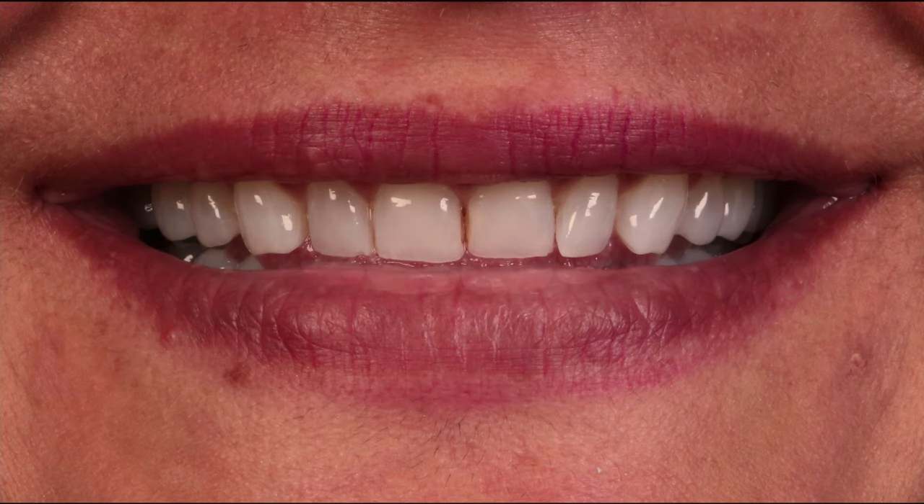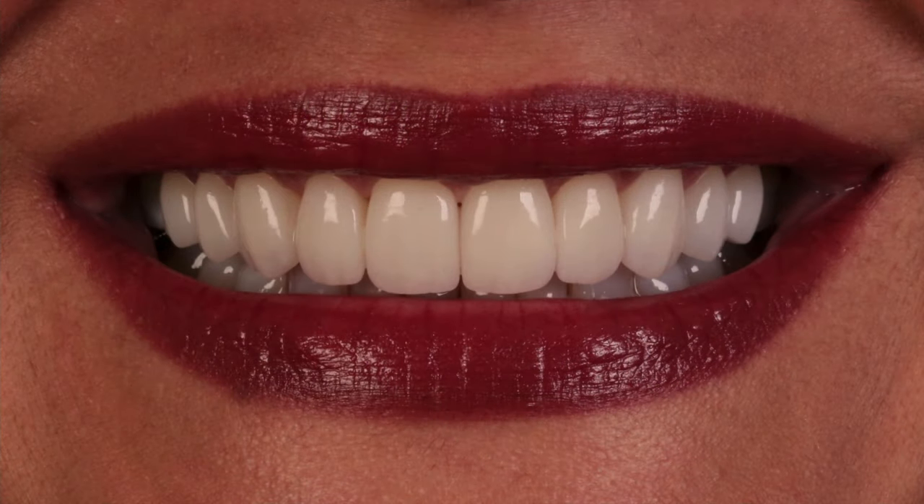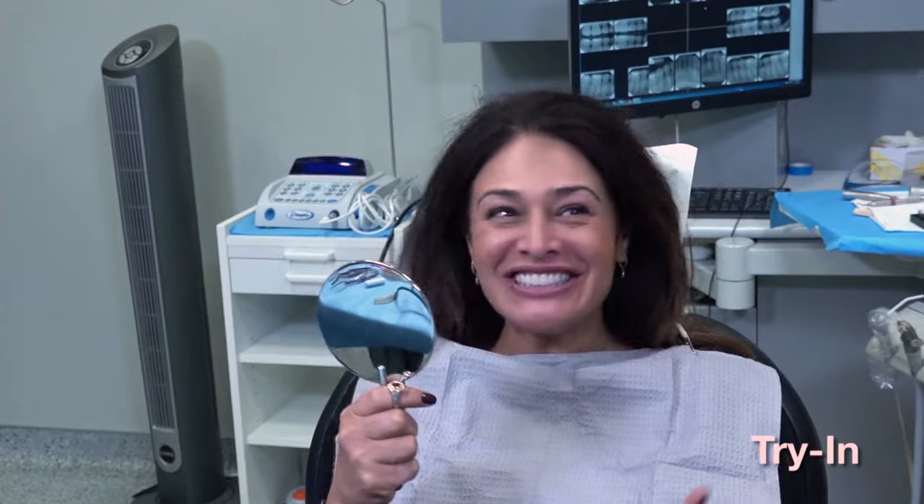That's where our patient started, and these are the finals. It's always fun to see the transition on our patient from before and after.